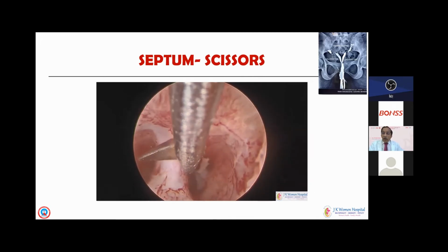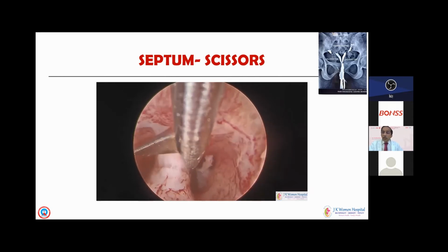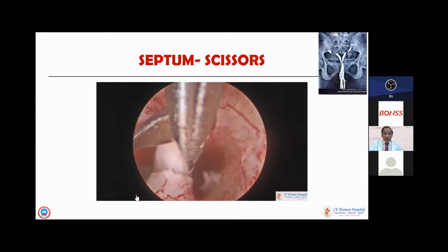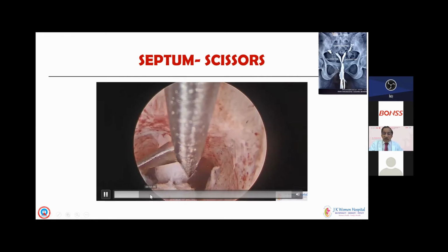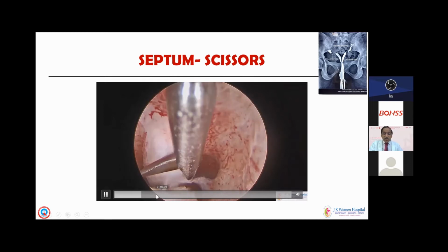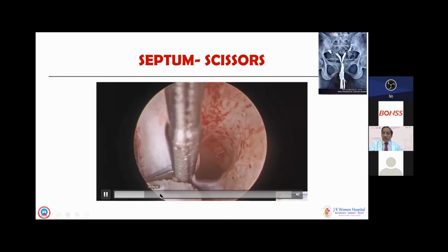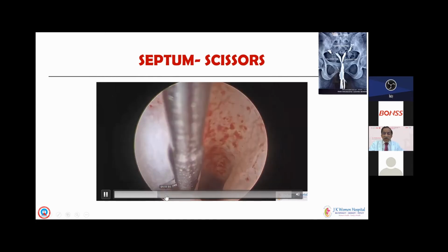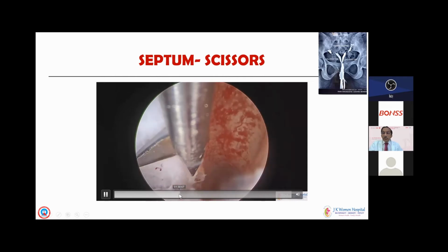Well, for us today, any septum, if you find in a patient within the reproductive age group, should be tackled, and we would recommend that you should start off with the 2 millimeter scissors, remaining in the midline, following all those principles of proper hysteroscopic surgery, identifying the tubal ostia, remaining in the midline. You can see 80% of the septum you can cut. As you go on to the base, you may get a little more muscular, vascular septum, where occasionally you will need to use the energy.